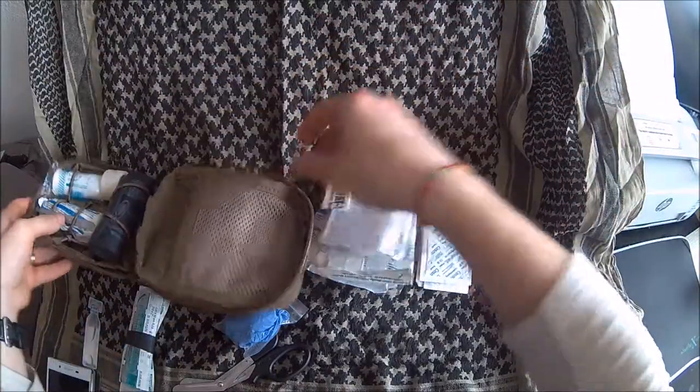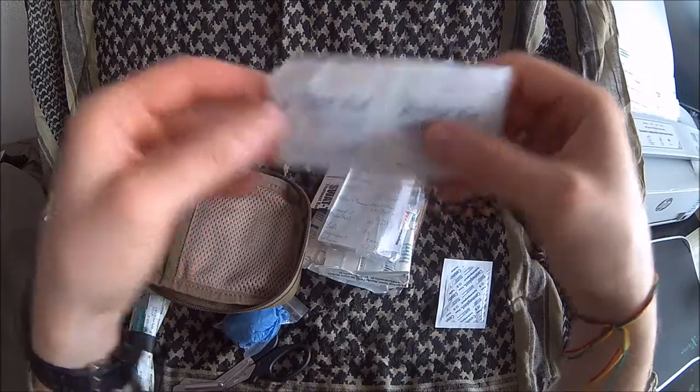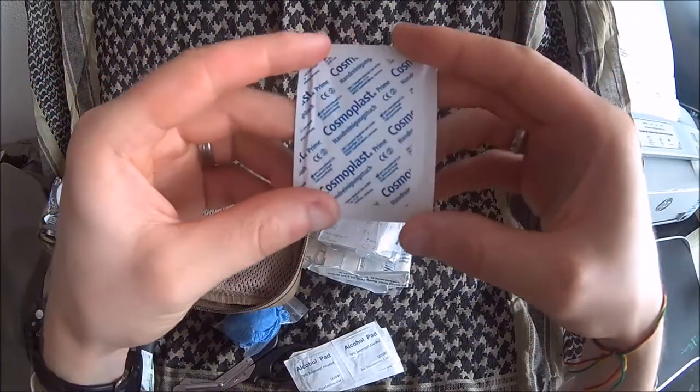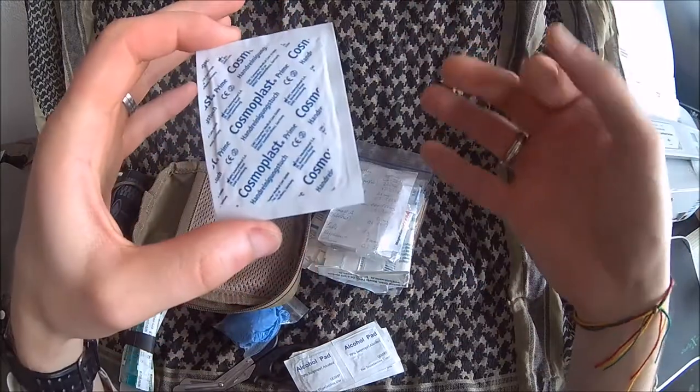In the mesh pocket we've got a few alcohol wipes — 70% isopropyl alcohol, so these are gonna burn. Then we've got a hand cleansing towelette for the patient or for yourself.